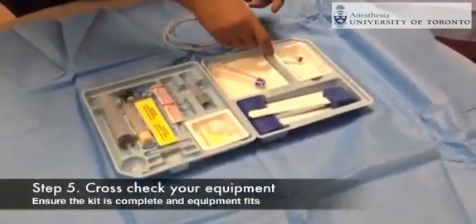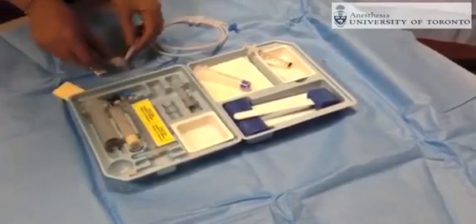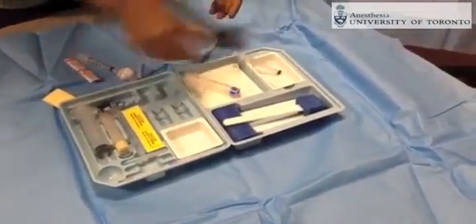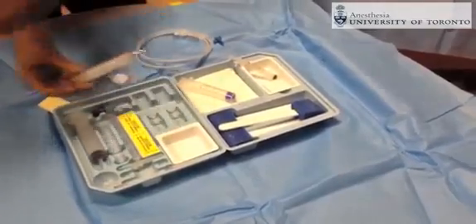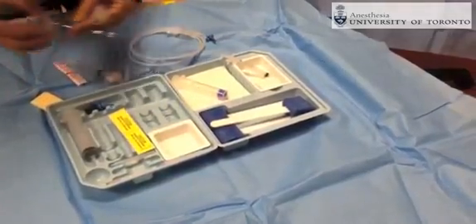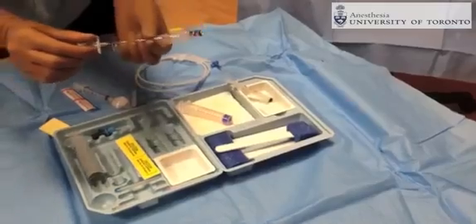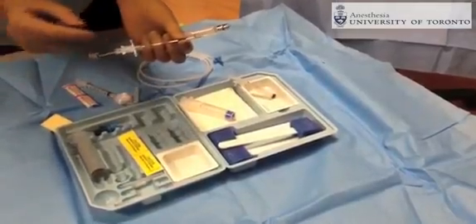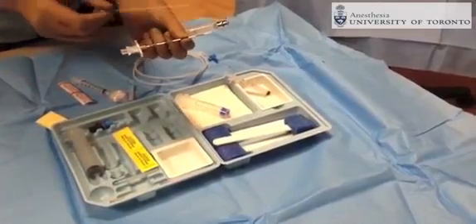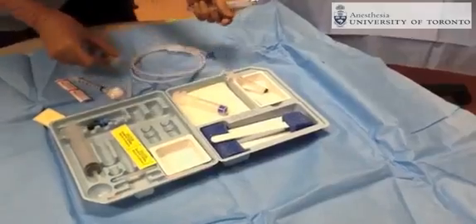Local anesthetic is placed in the trays. Usually a larger syringe is used for the loss of resistance technique, and a Tuohy epidural needle is used. As you can see, there is a special tip to the needle and a stylet inside. The catheter will feed through the large bore of this needle into the epidural space once the epidural space has been obtained through a loss of resistance technique.